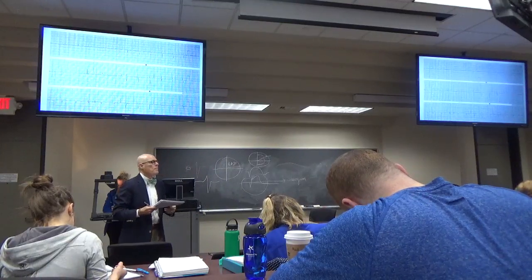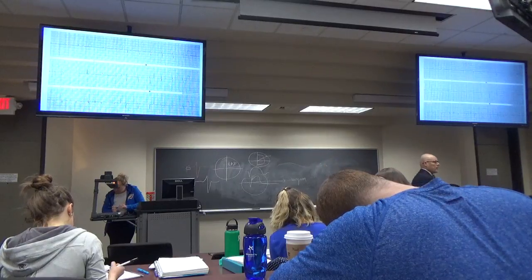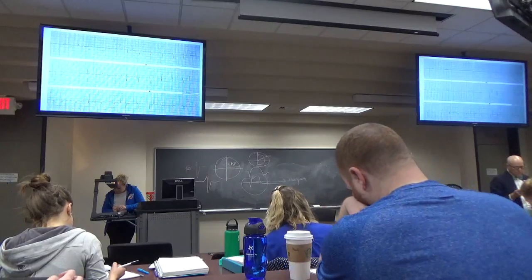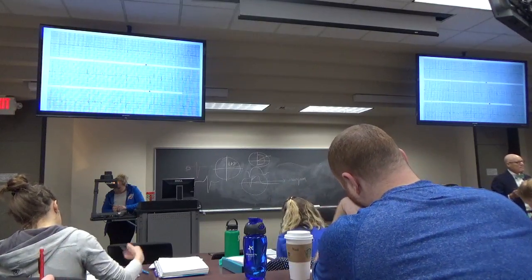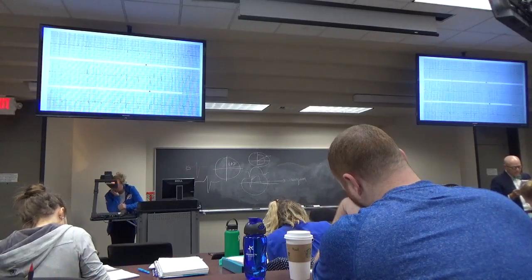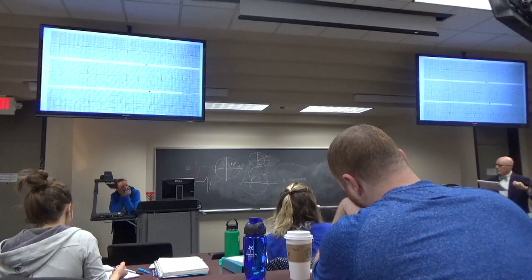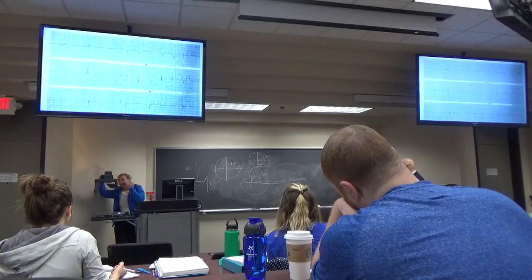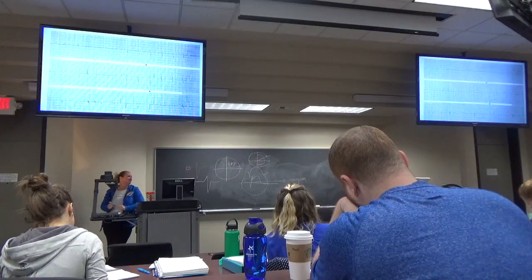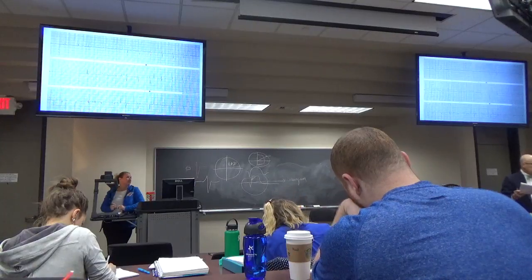Is there a little bit of an inverted T wave in the septal region? Well, in V1 there is, for sure. V1 is inverted. V2 is kind of flat. People would call V2 flat; they would call that a primary T wave change. In V3, it's upright. So it's below, then flat, then above. It's changing as you progress across. If you called this primary T wave changes in the anteroseptal leads, it'd be fine.